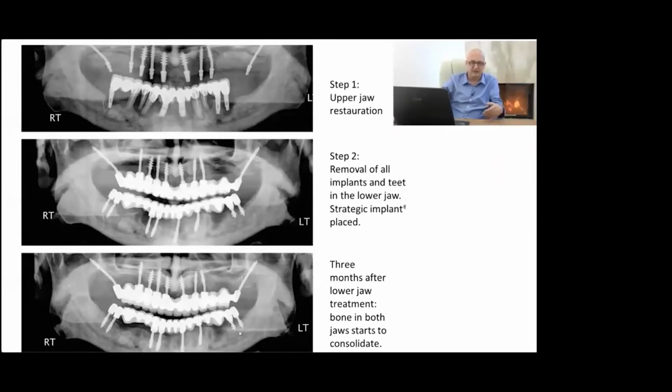So solving means taking out two-stage implants. I mean, we cannot improve it. No, we cannot talk it good. Simply, this implant needs to go out. Infection will stop automatically and instantly, and we can put new implants in, polished implants, thin mucosal penetration diameter, and everything is good. I'm not saying that there's never any problem with the corticobasal implants. There are sometimes problems, but at least we don't see periimplantitis. So we don't have this looming problem, which sooner or later hit almost every patient with two-stage implants.